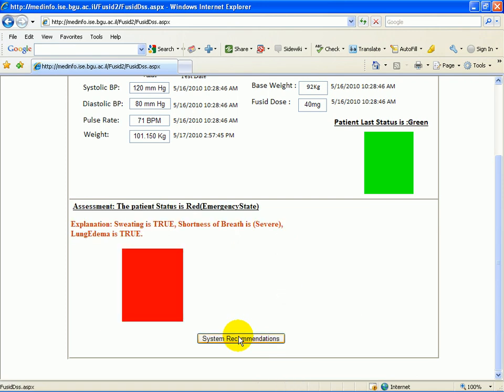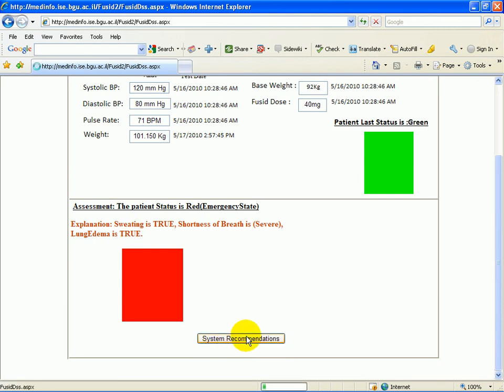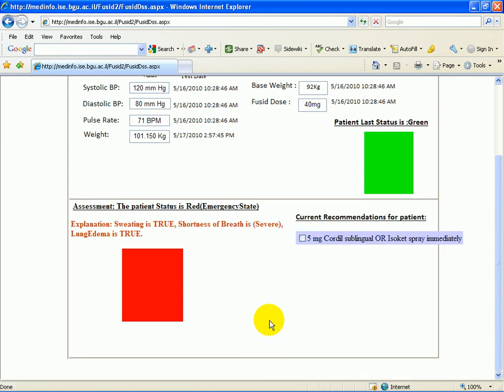As we can now see, the patient's status is red, emergency state, because he has met the condition of the medical guideline where sweating and shortness of breath and lung edema is all true. We will now proceed to the system recommendations as we guide the clinician through the individual steps of the guideline, making sure that no step is overlooked.